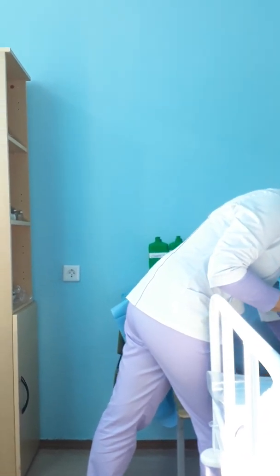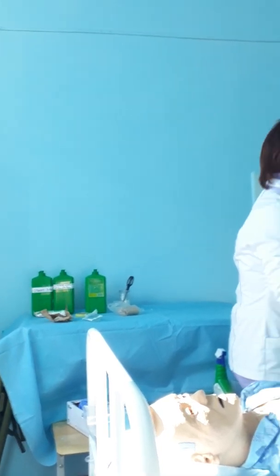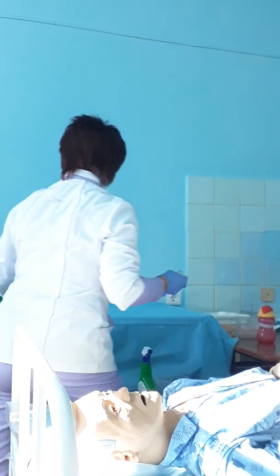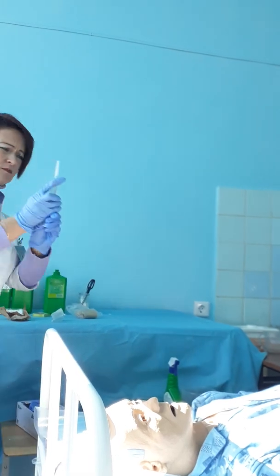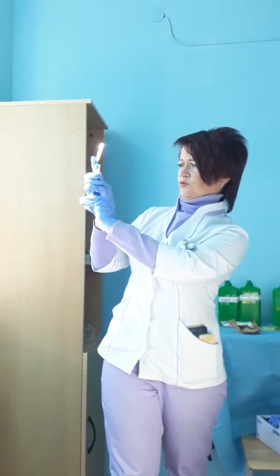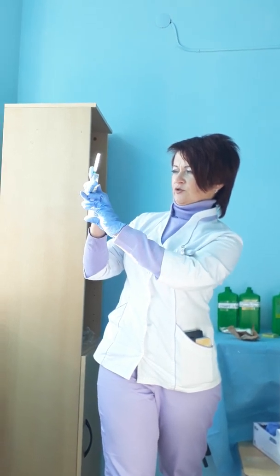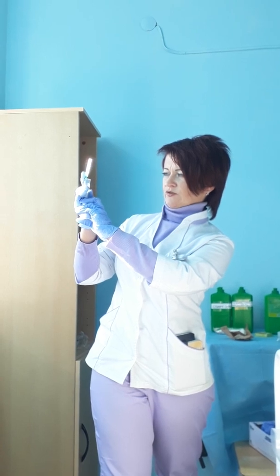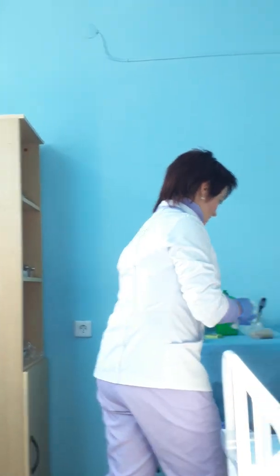Change this needle. Remove air bubbles. It's very, very important for intravenous injection. Make sure that air is absent in the new needle, and you see 1 or 2 drops of solution inside the cap.